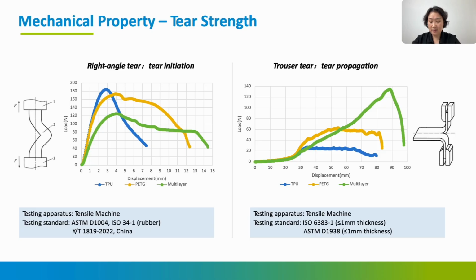Please note that these properties are tested in air and before usage. Mechanical properties of different materials may change in oral conditions with individual habits, cleaning methods, and so on.